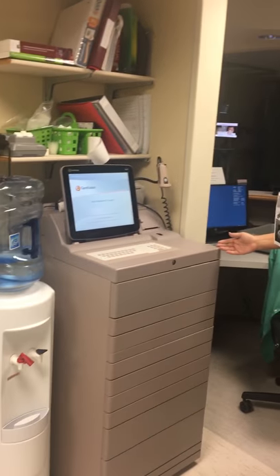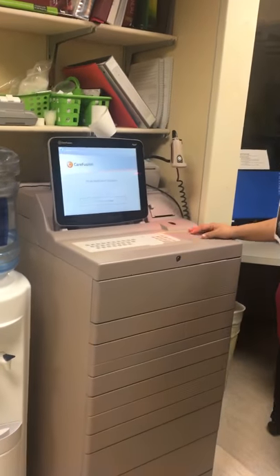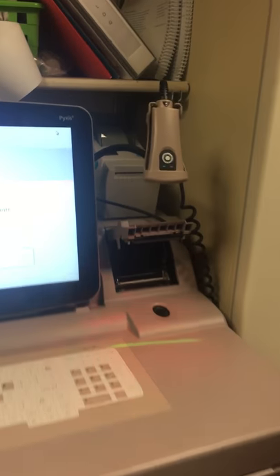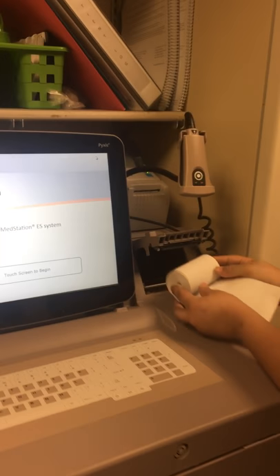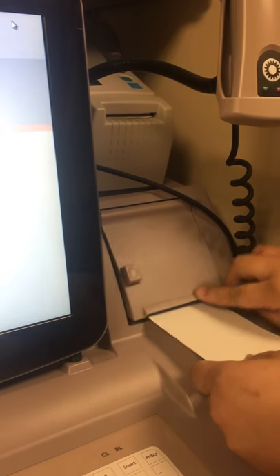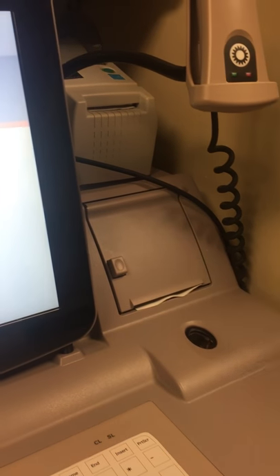This is our Pixis. It has a scanner, a screen, keyboards, and a slot for our paper. To load our paper, we will put it in as such, close it, and it will automatically align itself.